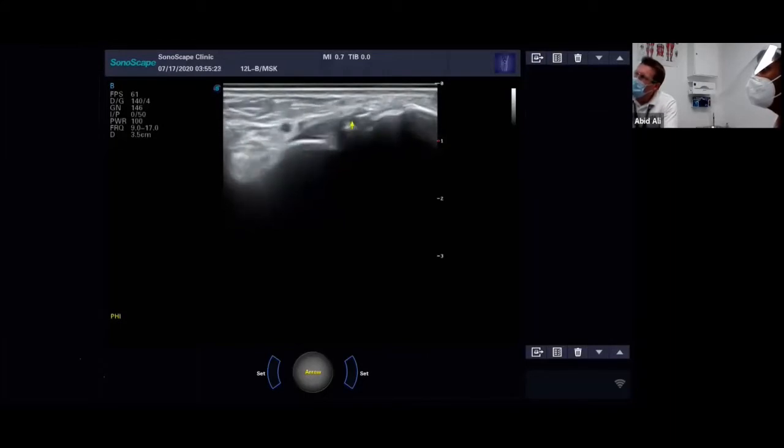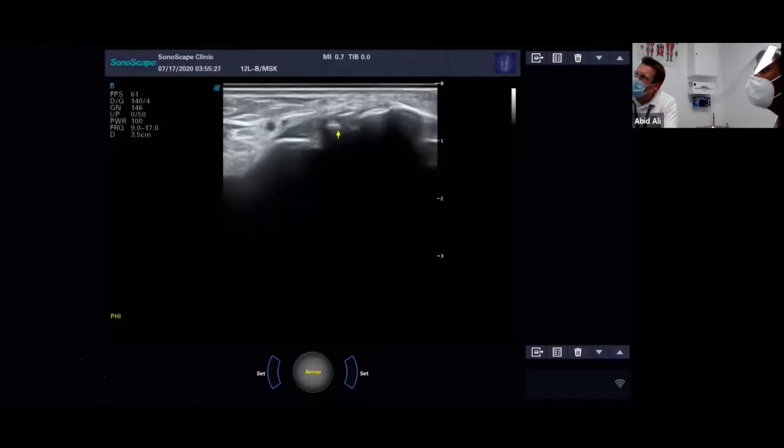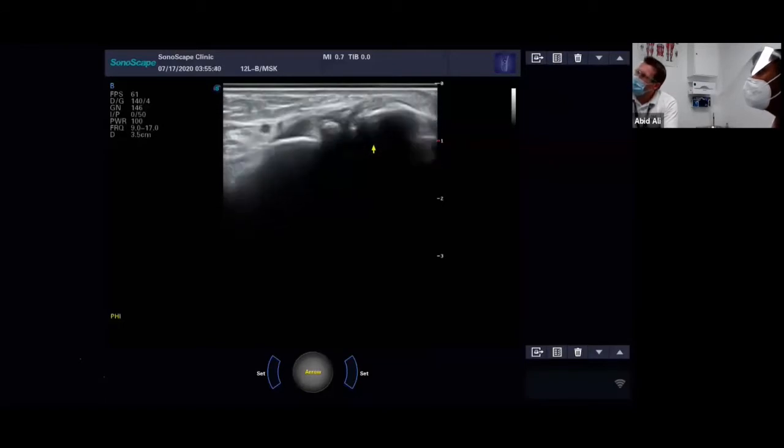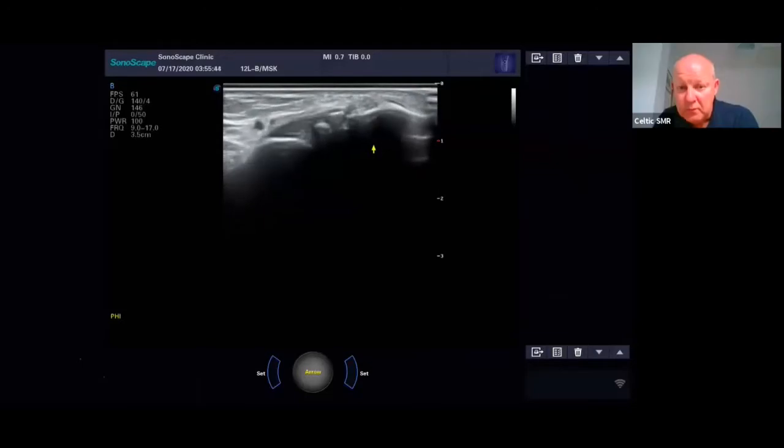There's two fascicles to the ATFL. There's a superior and inferior. But when you've had an injury, you tend to only just see it as one big lump of ligament. So yeah, that's abnormal. It shouldn't look like that. It should be a nice straight line. That's how you move it. Inversion, slight inversion to test it.